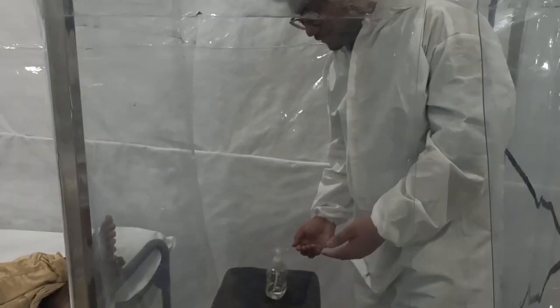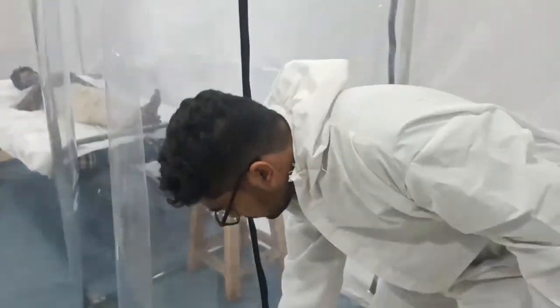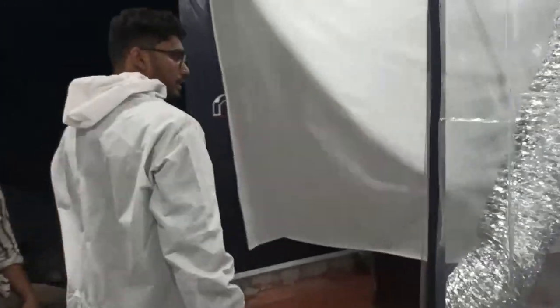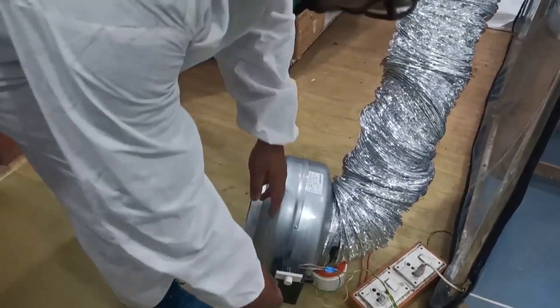Before we go out, we can sanitize ourselves and seal the unit. This is the exit point for the exhaust air, and the pressure inside can be controlled by adjusting the knob on the pump.